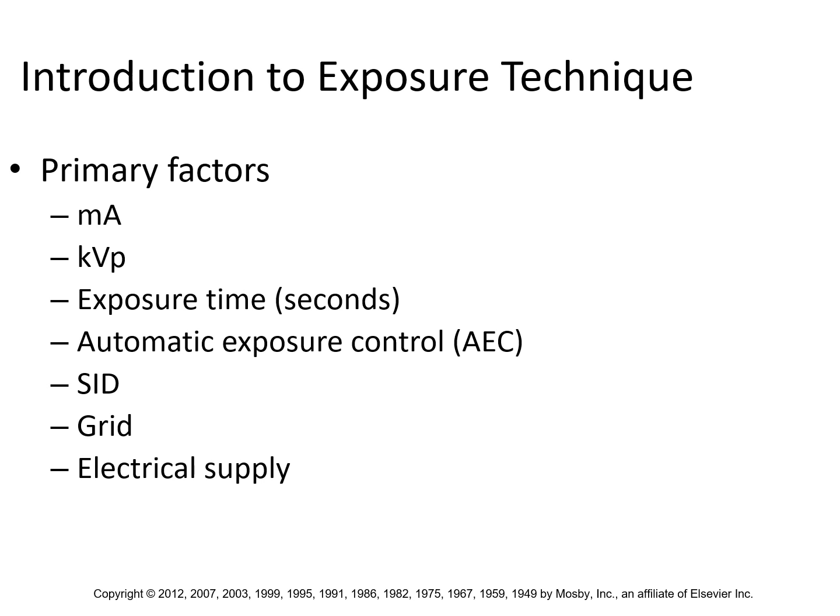Okay. What kind of a sensor is it? It's a sensor of ionizing radiation. So we have this device. It's embedded in the image receptor in the Bucky trays, right in front of the grids. We have these little sensors. We call them AECs. When they get hit by a certain threshold of radiation, a certain number of photons, they're going to activate and they're going to kill the exposure switch, and so the X-ray machine is going to shut off and it's not going to expose anymore.